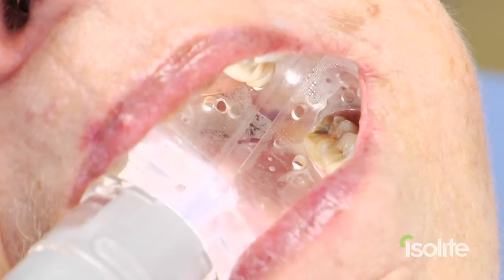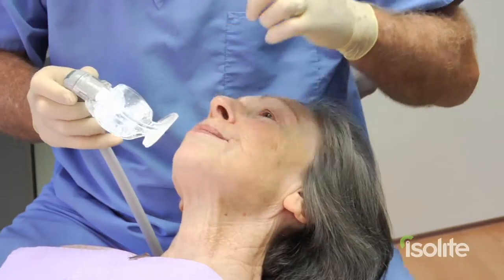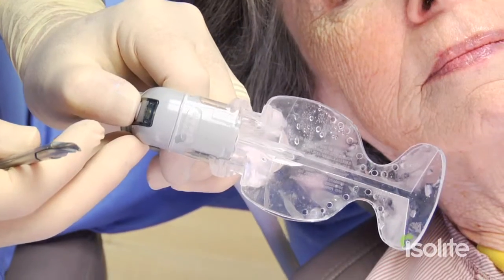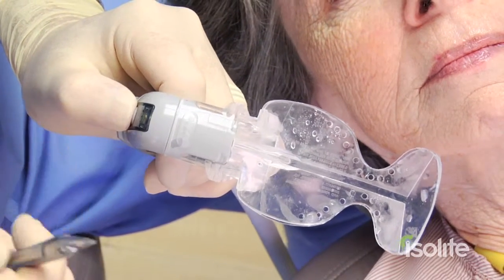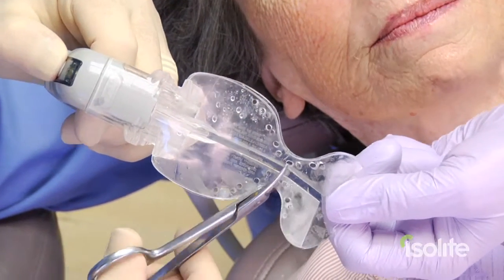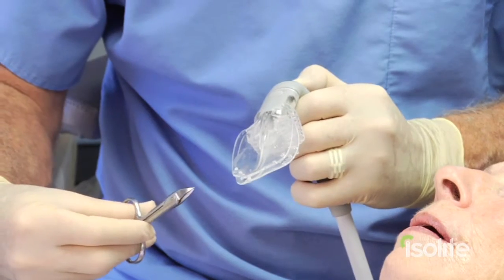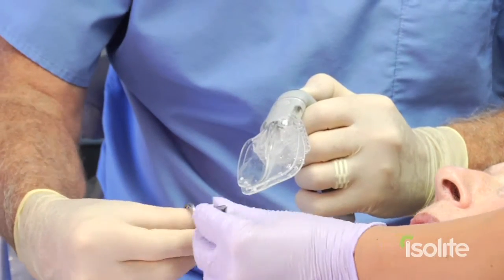What we're going to do now is get ready for the PVS triple tray impression. First of all, I'm going to remove the Isolite mouthpiece from her mouth — I need a pair of scissors. I'm trimming the cheek retractor, the part that I call the whale's tail, off of the Isolite so that it doesn't drag any impression material away from the tooth. You can trim this very easily and it does not change the function of the Isolite whatsoever.